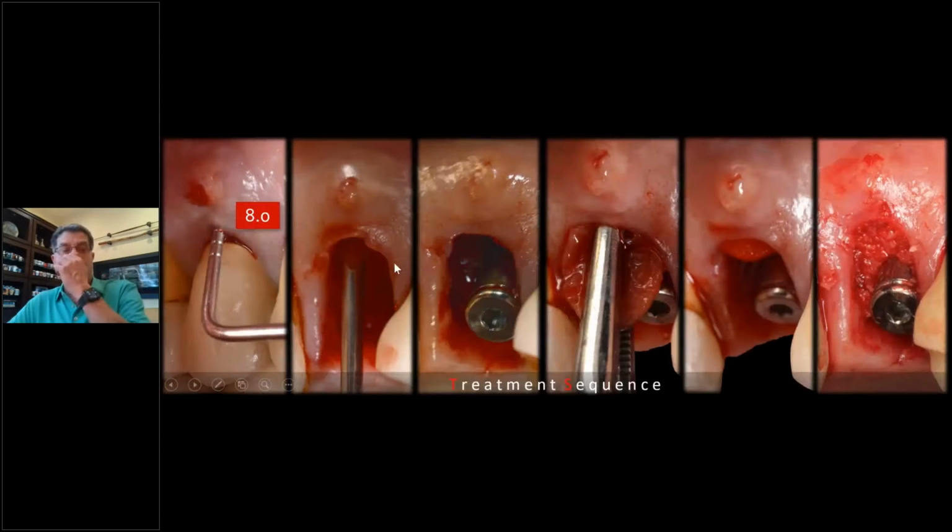And here's what it looks like, even with an infected buccal plate, as you see here with an abscess. Took the tooth out, cleaned it out thoroughly. You must debride it. It's just like Dr. Elaskary said, you go in, you clean, and you debride it. Now, implant, look at the gap distance. Beautiful. Because this is particularly bicuspids. So this goes into the palatal root, still comes out the central fossa.